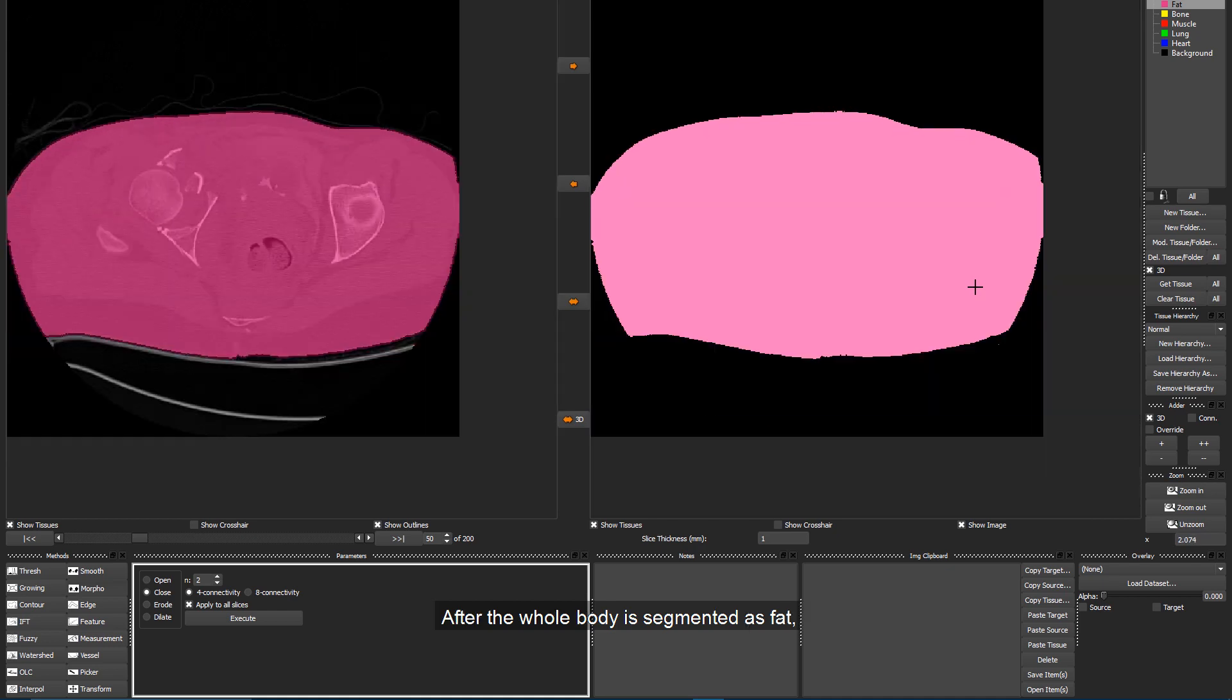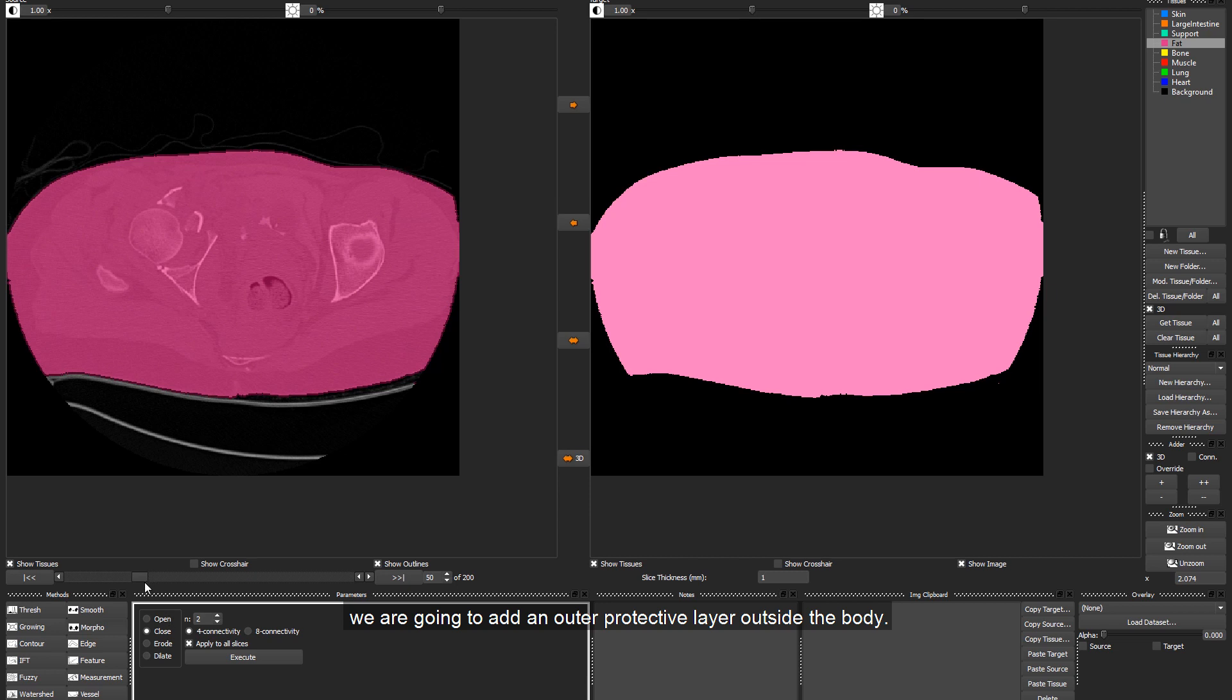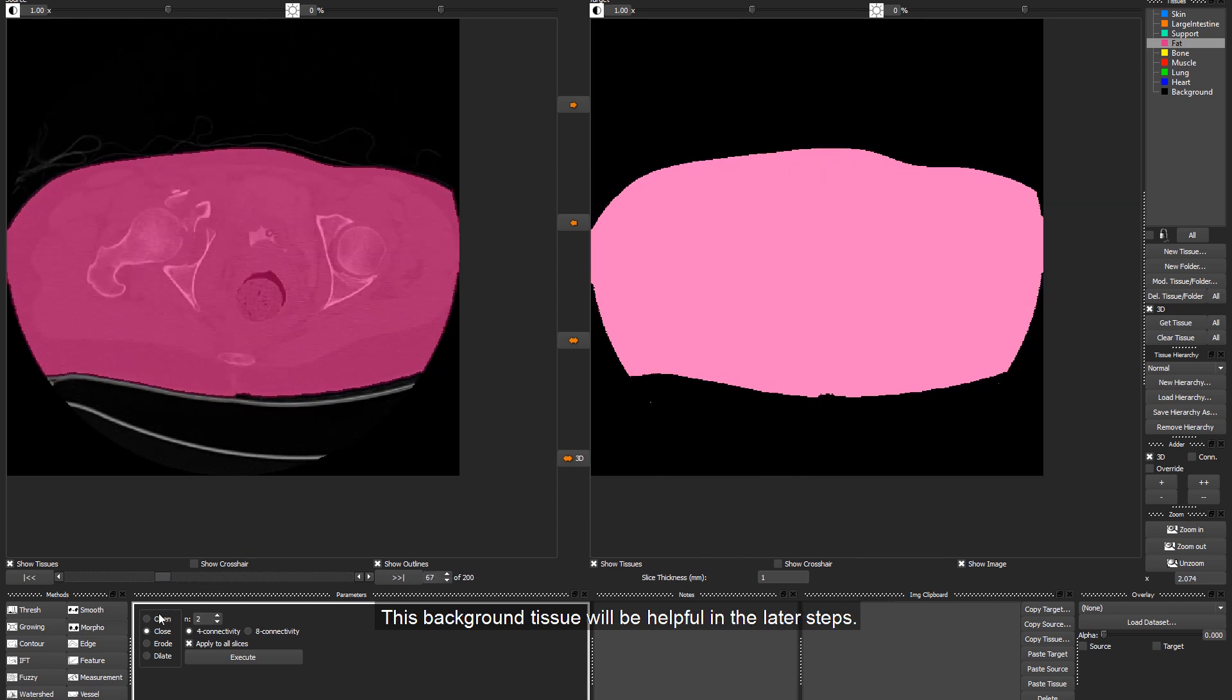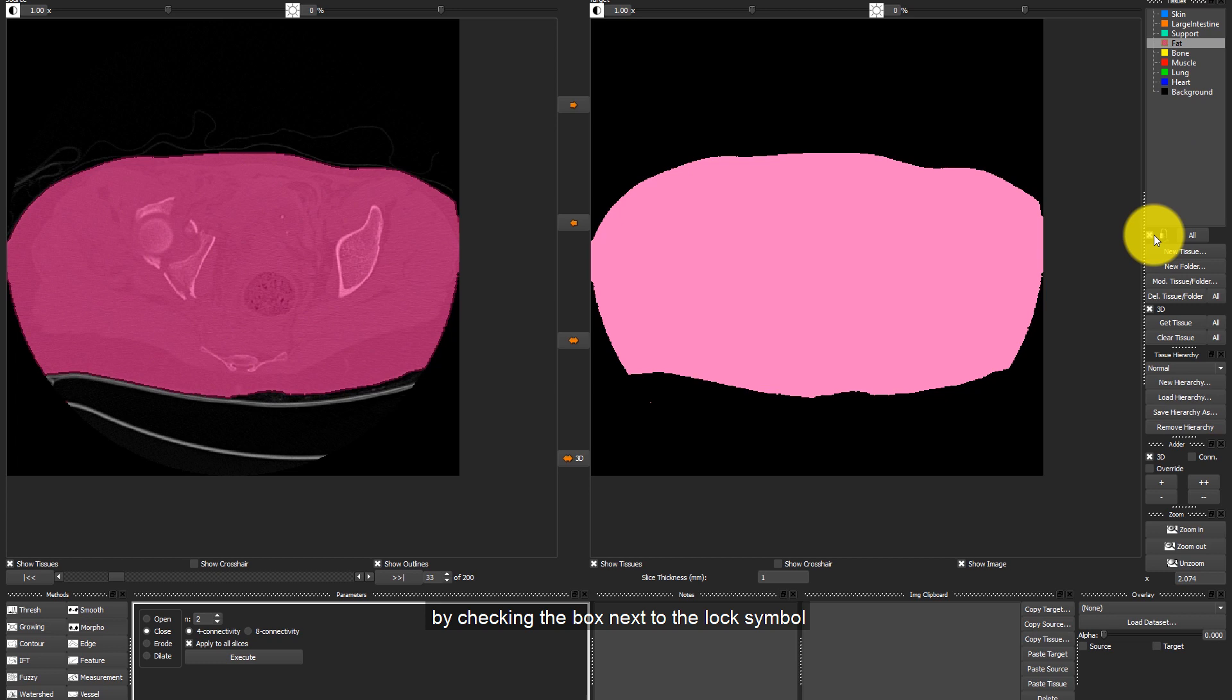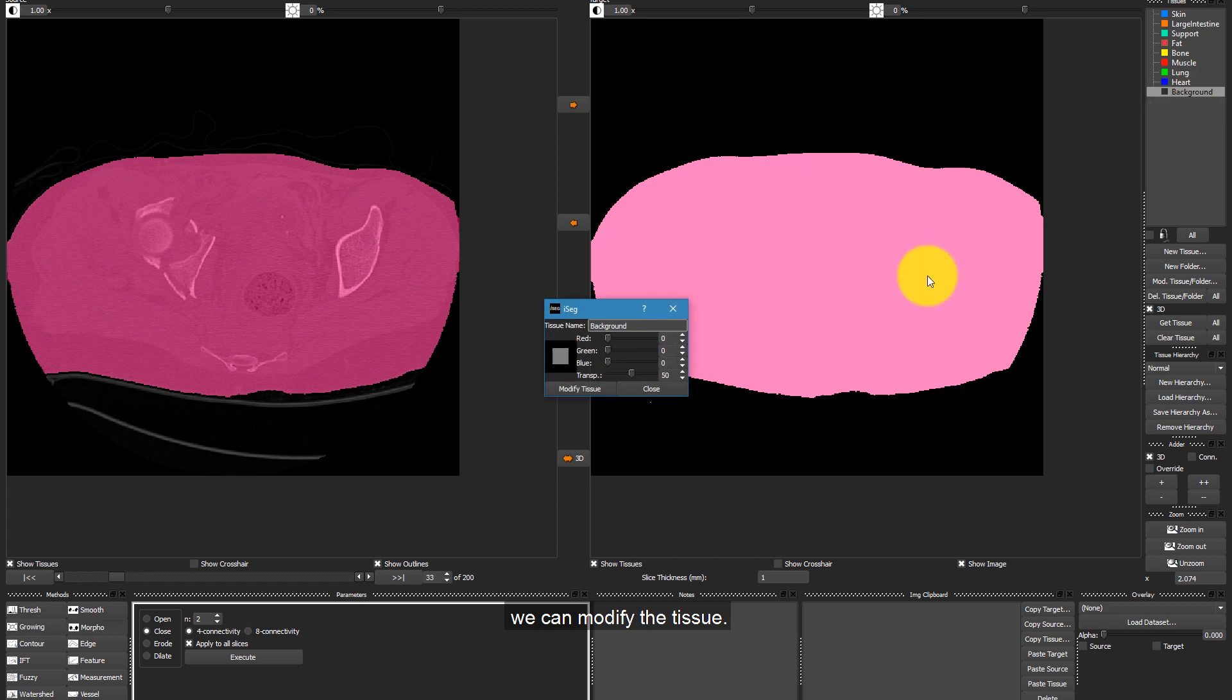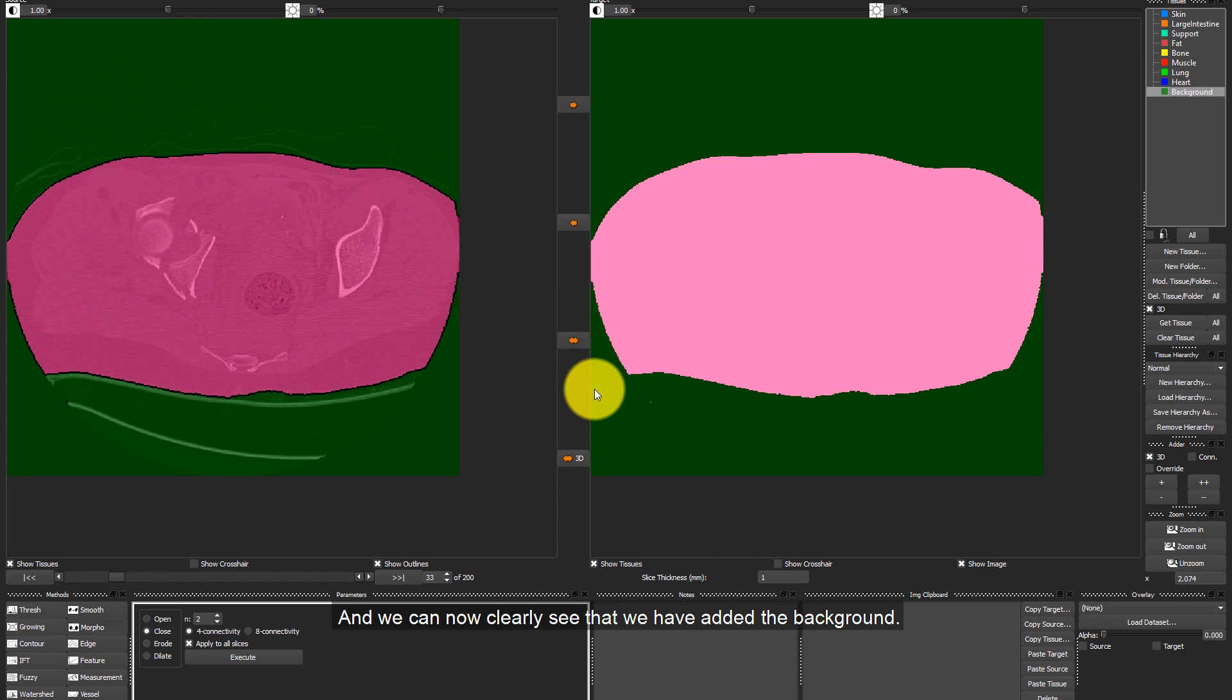After the whole body is segmented as Fat, we are going to add an outer protective layer outside the body. This background tissue will be helpful in the later steps. To add this tissue, we first lock the tissue, Fat, by checking the box next to the lock symbol, and with the Other we add the background around the body. Since now the background is black and we cannot clearly see, we can modify the tissue. For example, by changing the color. And we can now clearly see that we have added the background.